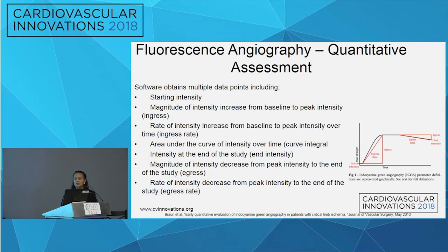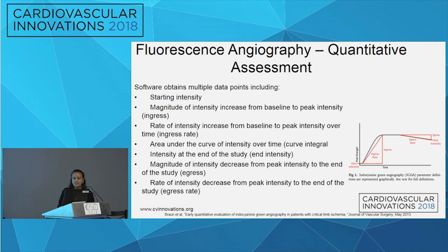For quantitative analysis, the software measures the intensity of the ICG — the magnitude of intensity from baseline to peak, called ingress; the rate of intensity; and the magnitude and rate of intensity from peak to the end of the study. These are things the software does automatically to measure the intensity of the fluorescence.